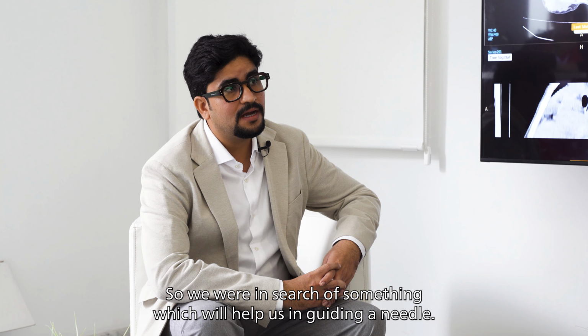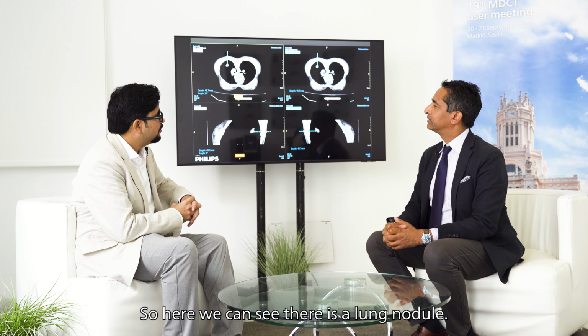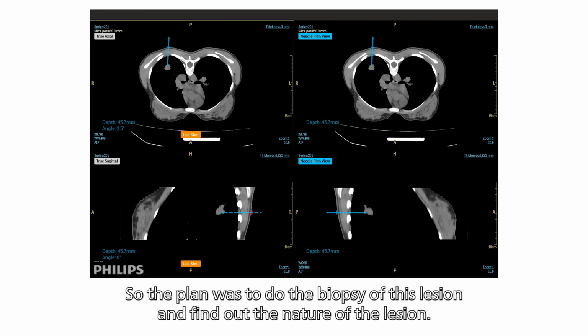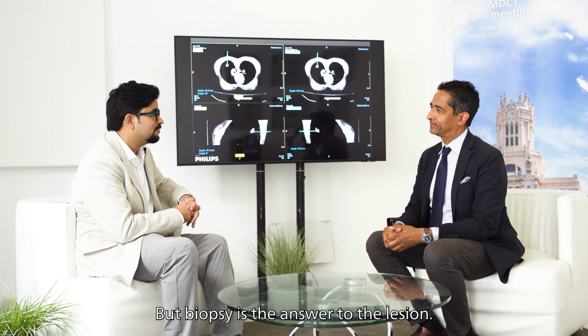And you're showing a case of a right lung mass. Yeah. And maybe you can walk us through the process of what we're seeing. Yeah. So here we can see there is a lung nodule. So the plan was to do the biopsy of this lesion and know what is the nature of the lesion. So is it a malignant or a benign lesion? So biopsy is the gold standard, whatever imaging you do, but biopsy is the answer to the lesion.